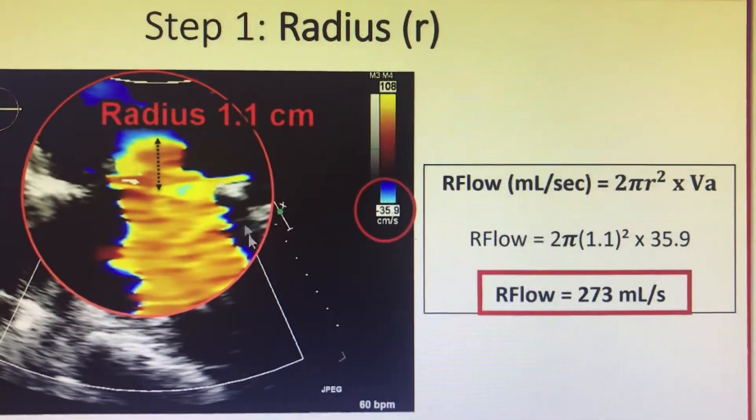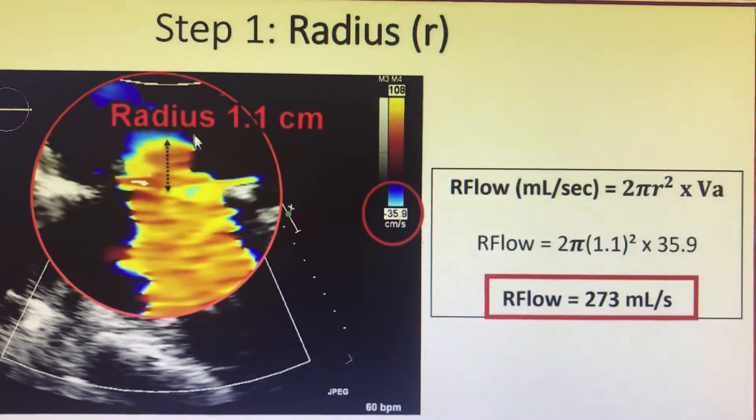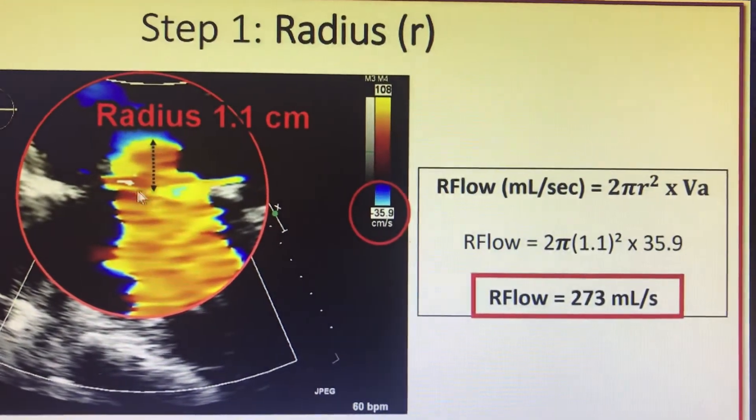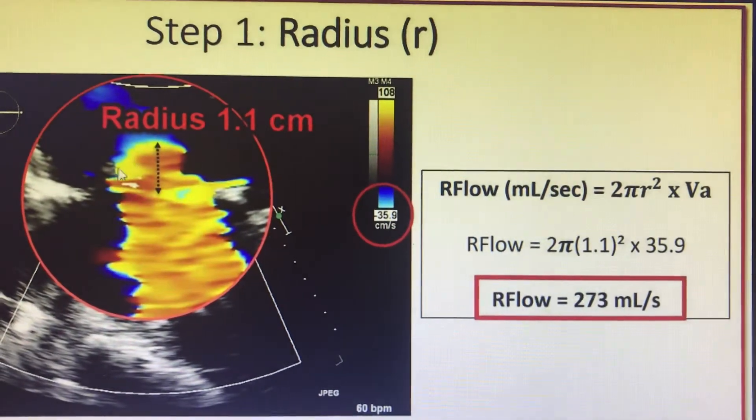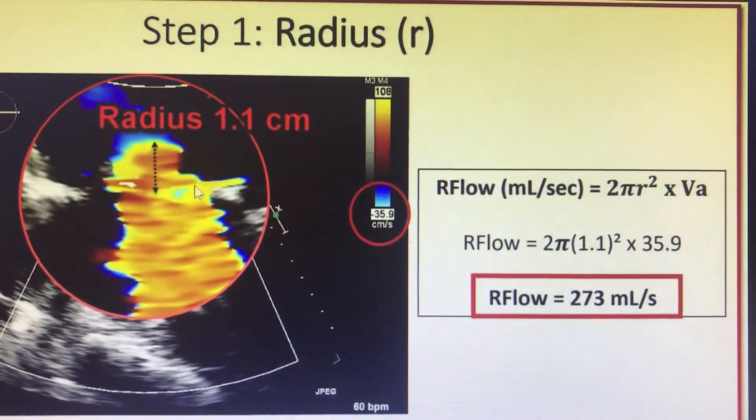You focus on a view that is apical 4 chamber, you get the regurgitation into focus and zoom it. While zooming it, you see that there is a hemispheric convergence zone being created at the valve level.